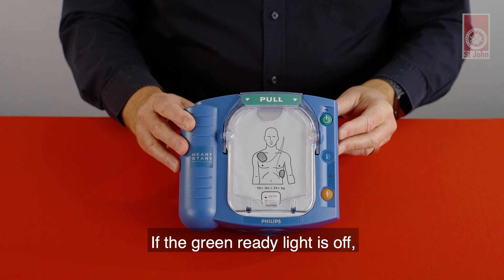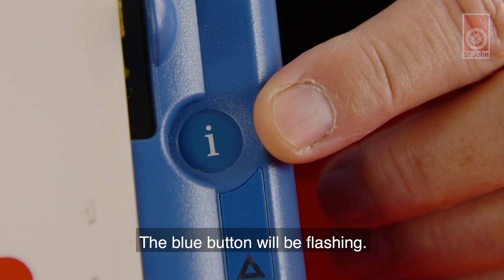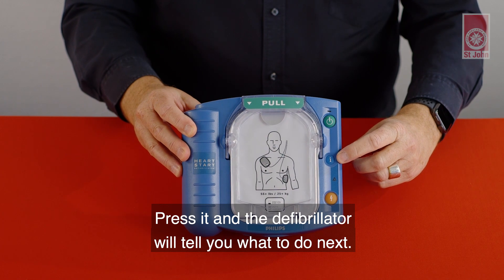If the green ready light is off or you hear a pattern of single chirps, the blue button will be flashing and the defibrillator will tell you what to do next.